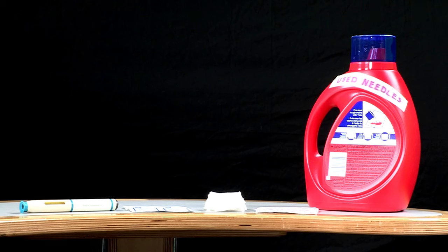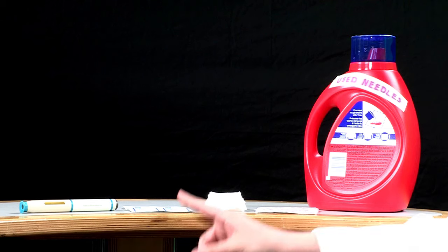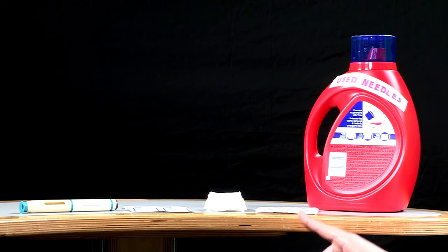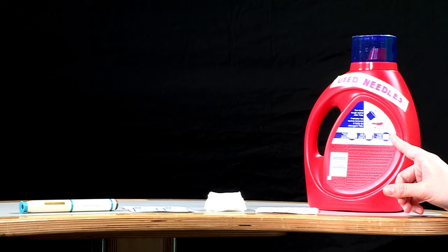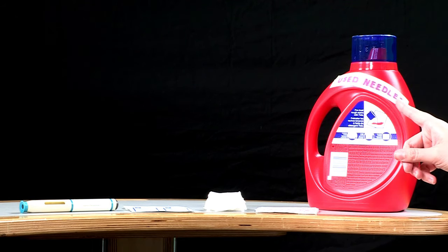Gather all materials needed for your injection. These materials include alcohol wipes, cotton balls or gauze pads, adhesive bandages, and the sharps disposal container. If you don't have a sharps disposal container, use an empty liquid detergent bottle and put a label on it that says 'used needles inside.' Ask your VA provider or pharmacist how to dispose of the full sharps disposal container or liquid detergent bottle.